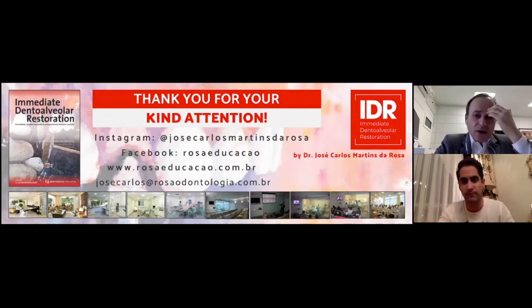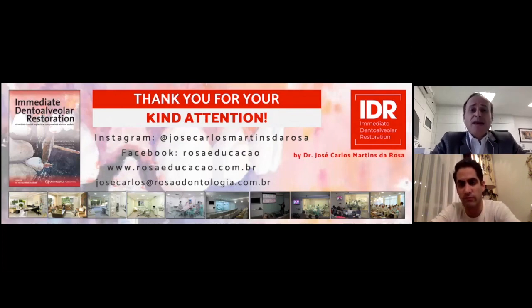Yes, to tell you the truth, the graft is stable just by the position, by the adaptation between the configuration of the graft and the remaining bone tissue. This is what we call the primary stability, and the second and final stability of this graft is obtained by bone compaction using particulate bone graft all around the head of the implant. My recommendation for beginners is that you cannot leave any empty space in between. If you leave any empty space, you could compromise the result. So the tighter it is introduced, the better the result will be.